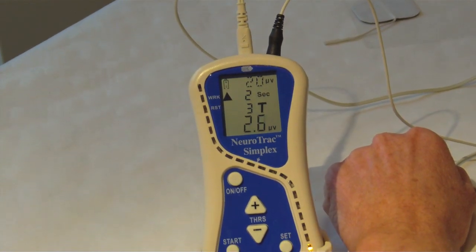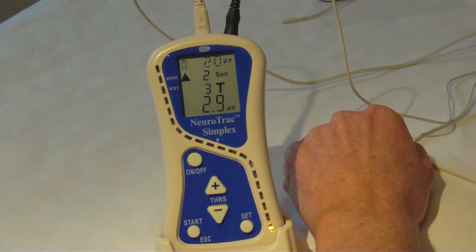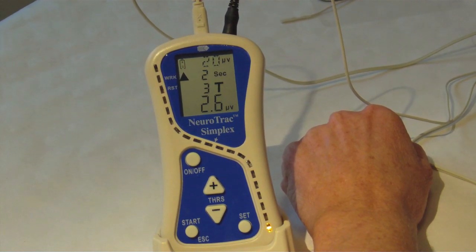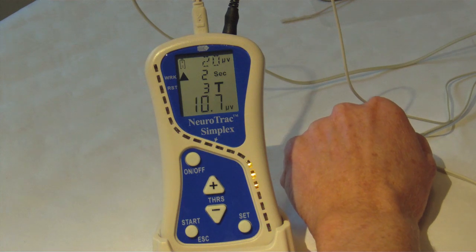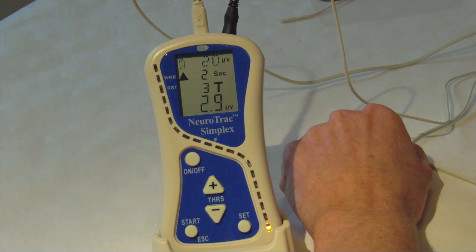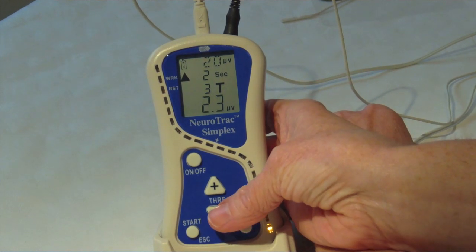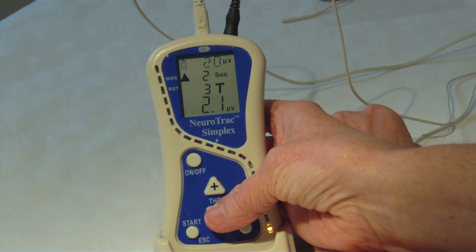Your healthcare professional will use the following steps to set up the unit. Firstly you will tighten your pelvic floor muscle for 5 seconds — this value will vary but a note will be made of the maximum number achieved. 50% of this number will be calculated; for example if it's 36 then half of that will be 18. This is your threshold level, which can now be programmed using the plus or minus threshold button. Once the number is correct, press set.